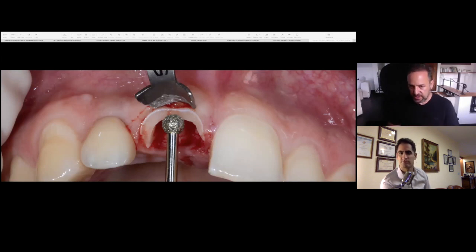And these are gingival retractors. These ones are nice because they are titanium. I don't like the metal retractors because the other metal retractors are stainless steel, and you can see sometimes we hit the shield, and I don't want stainless steel metal shards going into my area. If I hit it, the best thing I want is titanium. And the reason we can't use ceramic is that we can't bend them. The nice thing about the titanium is it's soft, and I can use an orthodontic pliers to mold it so that it goes around the different shapes of tooth that I use.